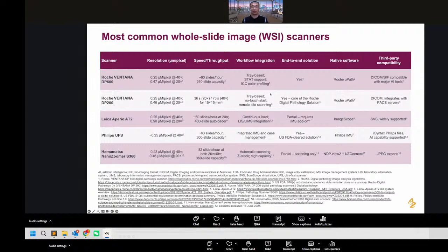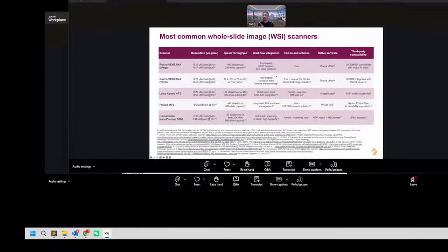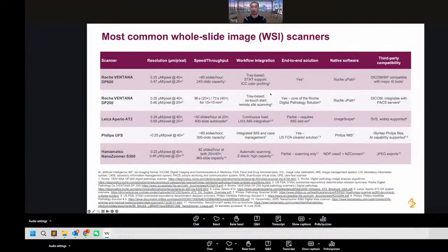The third question is roughly how much it costs to set up a mid-sized digital pathology lab. I guess the majority of you are very right: it's $2 or $3 million. About 30% gave this answer. It can be more or less, depending, but I think roughly the ballpark is 2 or 3 million.